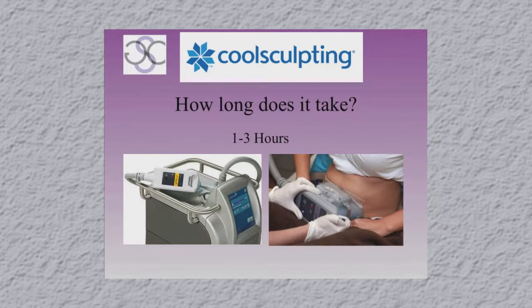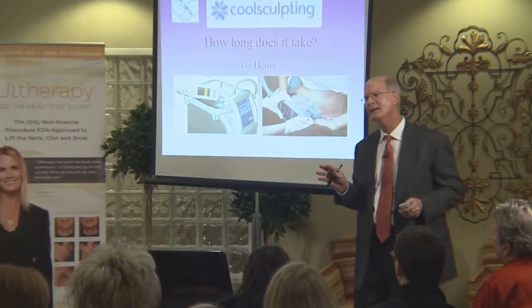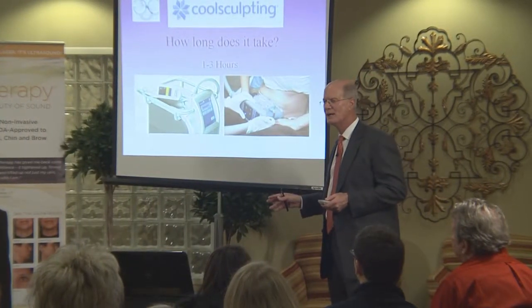If you do your tummy, it's an hour. There are fancier ways to do your tummy, where you do the right side and left side to try to sculpt it, and then it's still 1 hour per site. You can do the inner thighs for an hour, but you've got 2 inner thighs and 2 hips. The cool thing is, if you come in on your lunch hour and you only have an hour, you do 1 hip. You can't do 1 hip in liposuction, that would be crazy, but you can do it with this and come back a day or a week later and do the other side. It's very scalable, and you can do it multiple times.